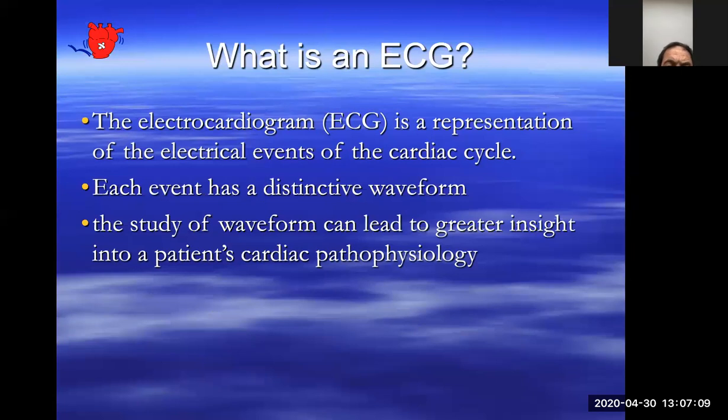So what is an ECG? What is an electrocardiogram, or EKG as the Americans say? The heart is a pumping machine. It needs fuel, which is the blood, but it also needs electricity to make it work. It's like a car, you need the electricity first to work. The depolarization, as you probably learned in medical school, is the electricity that precedes the contraction, and that is what we are measuring. So the heart makes electricity, and we can read it by this ECG.